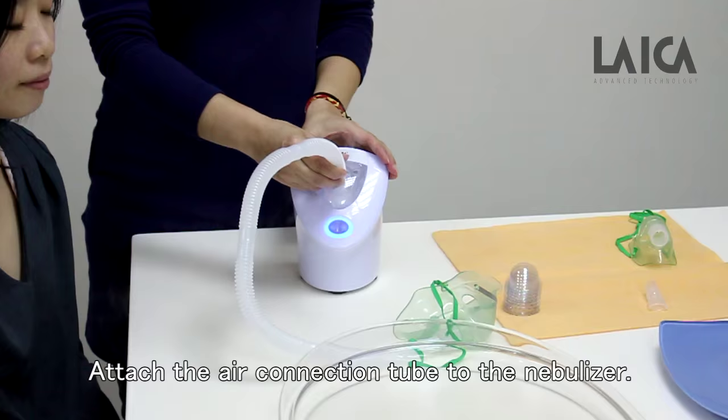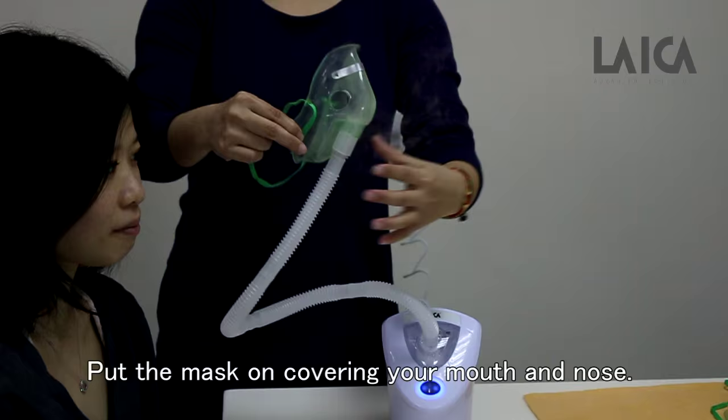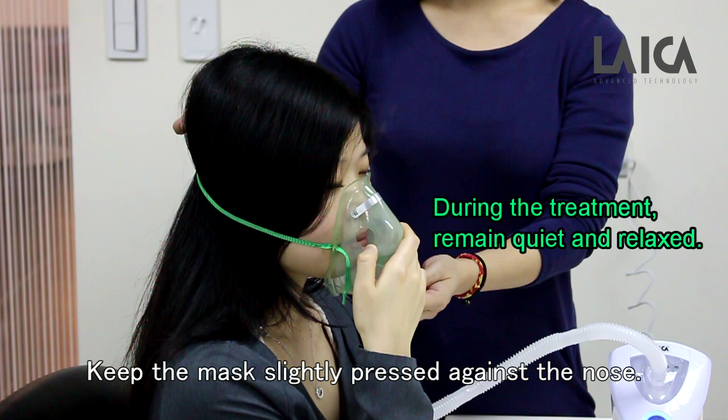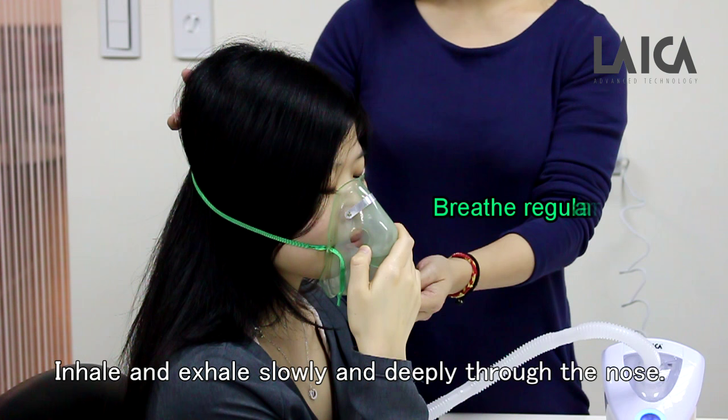Attach the air connection tube to the nebulizer. Put the mask on covering your mouth and nose. Keep the mask slightly pressed against the nose. Inhale and exhale slowly and deeply through the nose.